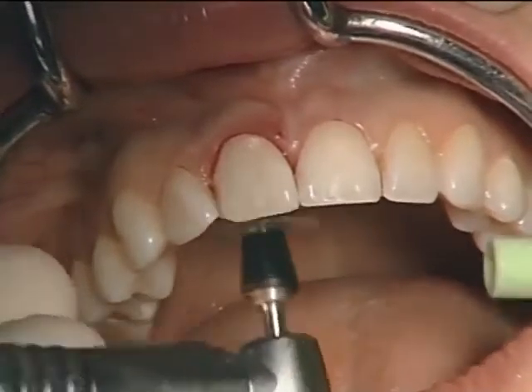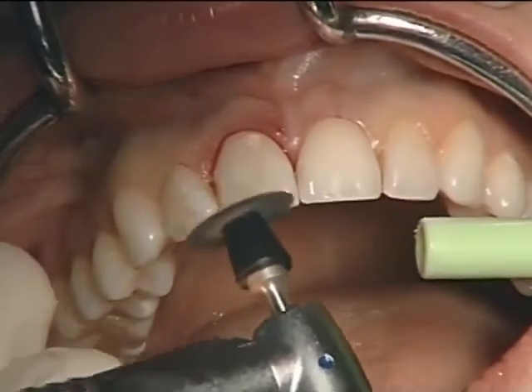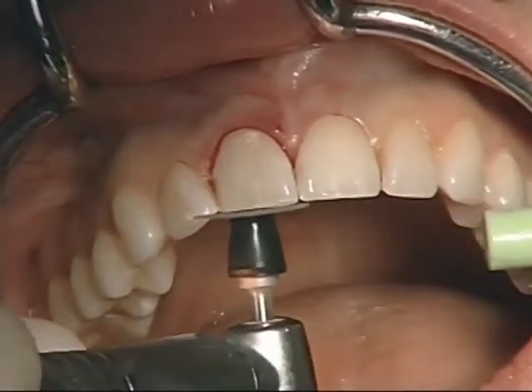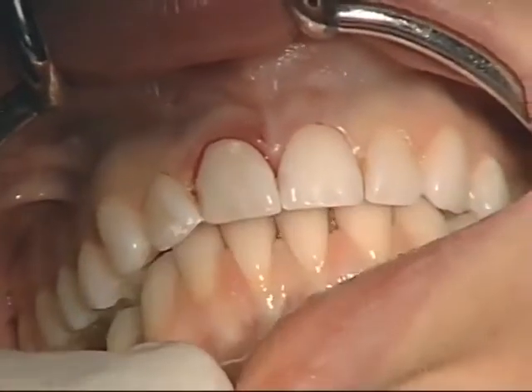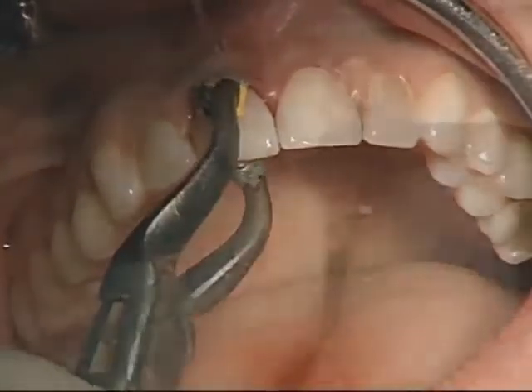And using our 3M discs to shorten the incisal edges and eliminate any protrusive contacts is accomplished prior to us retrofitting the margins of the temporary. Abutment is removed. It is then placed on an analog, the temporary placed back on, and then we retrofit back the margins with flowable composite.